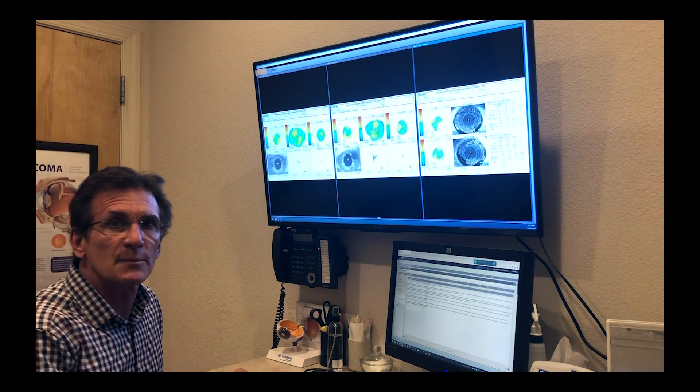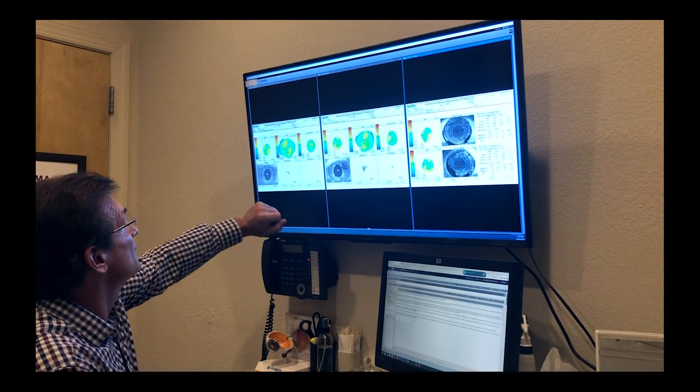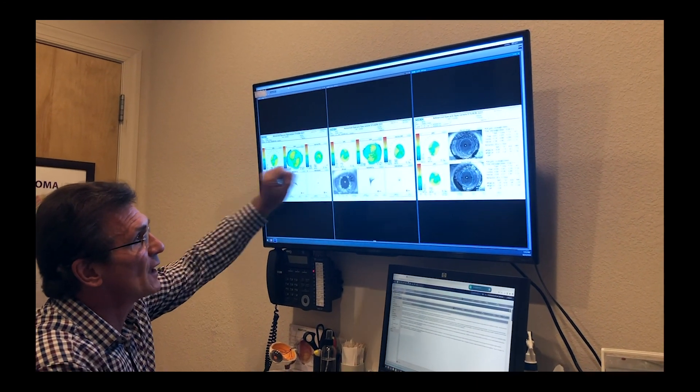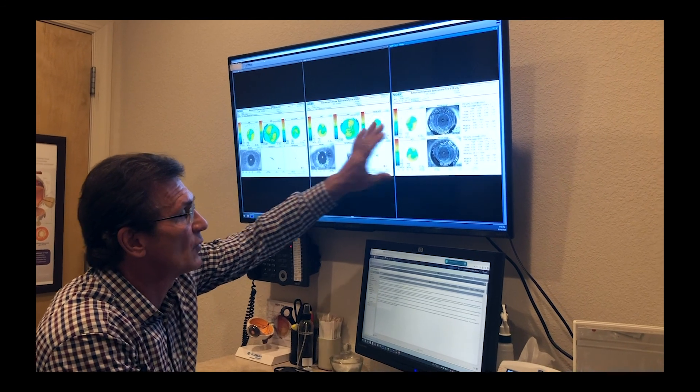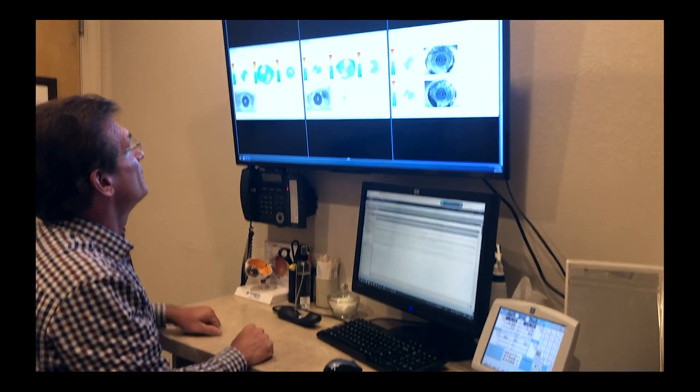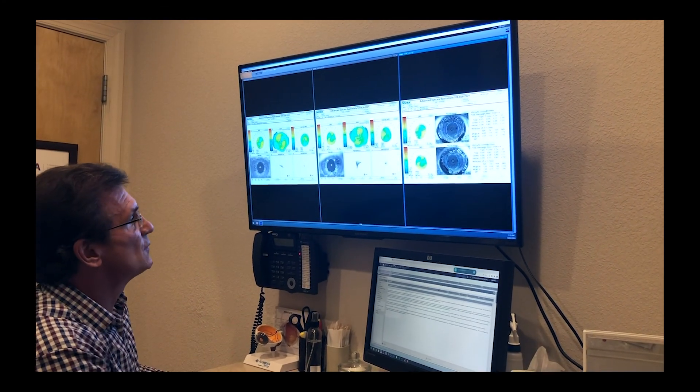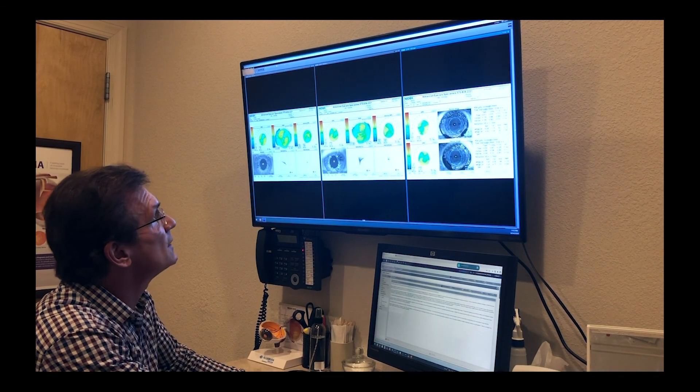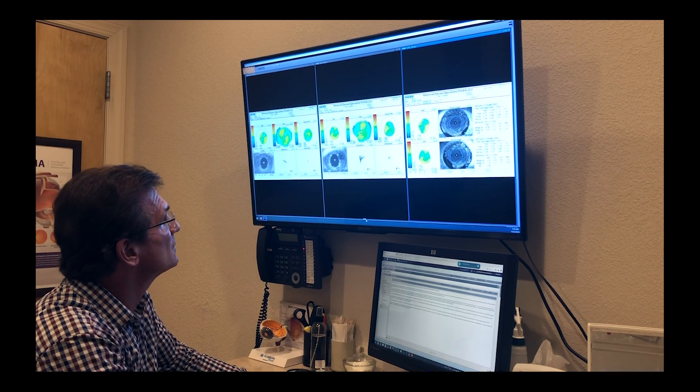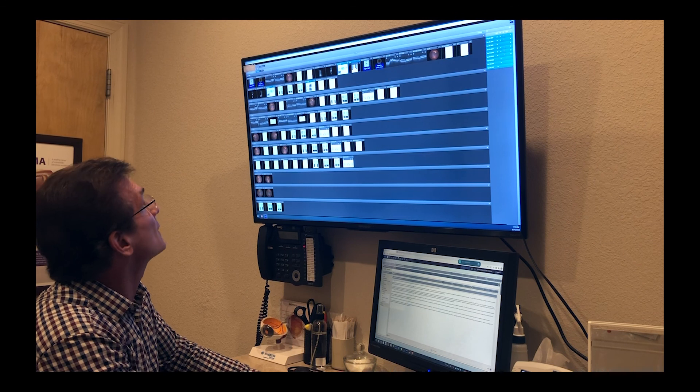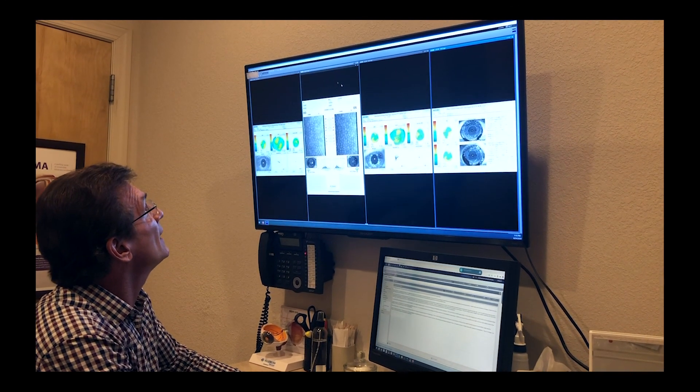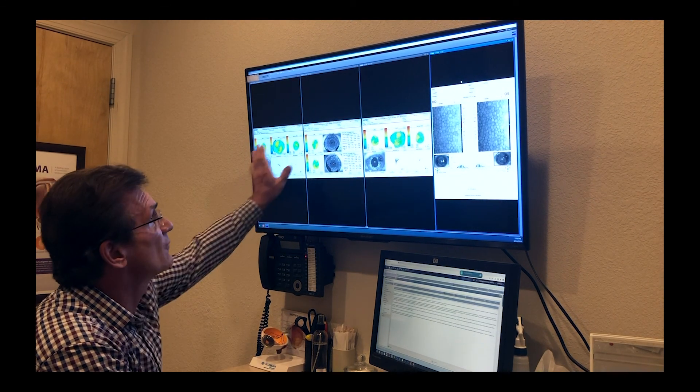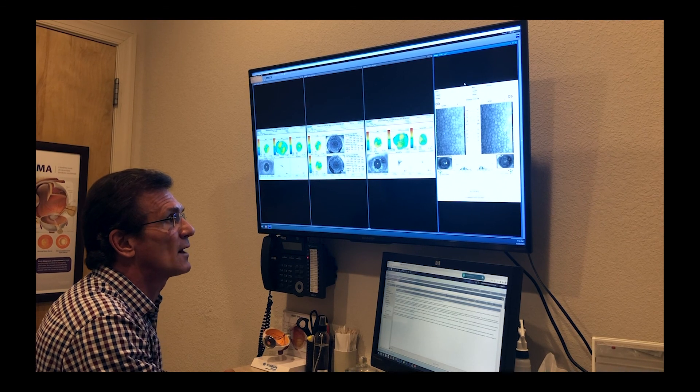When I first walk into my exam room, the first screens that I see are the refractive screens. Here's a picture of the corneal topography, the wavefront, the automated refractor, and how it pertains to the patient and the higher order aberrations. Here I have the refraction in the clinical data on my medical record screen. So I know this patient has Fuchs dystrophy and I know that we usually do a specular on our patients. So I'm just going to go back into today's examination and take a look. And there's the specular. I'm going to click on that, add that to my initial presentation. And if you want to, you can just take it and move it to where you want so you have refractive information. And then there's the specular microscopy.